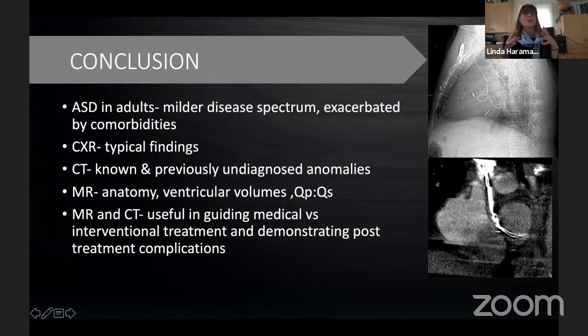If the central vasculature is prominent and there's haziness around the vessels, we think CHF. If the central vessels are prominent and the peripheral vessels are also prominent and they're very sharp, we think pulmonary overcirculation secondary to an undiagnosed shunt, and that we may help the patient in that way. CT use, as you see, we often do CTs for pulmonary embolism in people with nonspecific symptoms, and we have the opportunity to make a diagnosis of an unsuspected ASD. I actually had such a case last week.